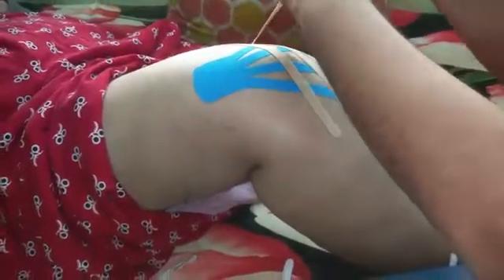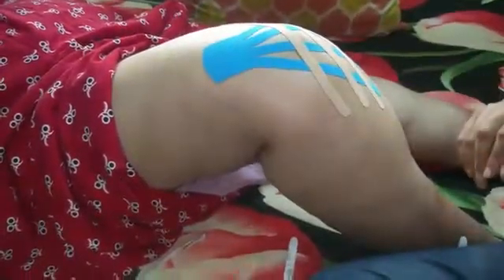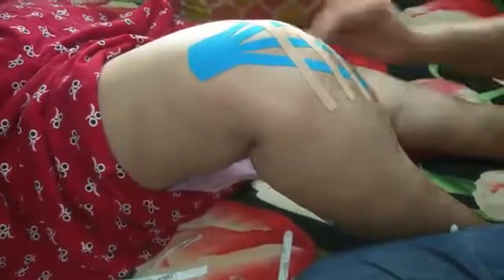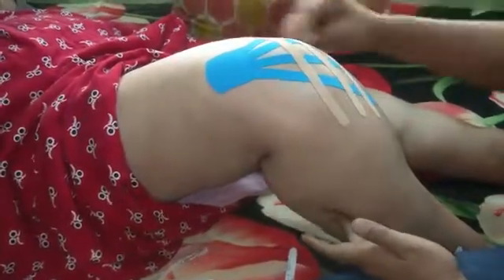This should stay for a couple of days in order to allow the drainage of the fluids. Warm the tape so the glue gets activated and it remains properly in place.